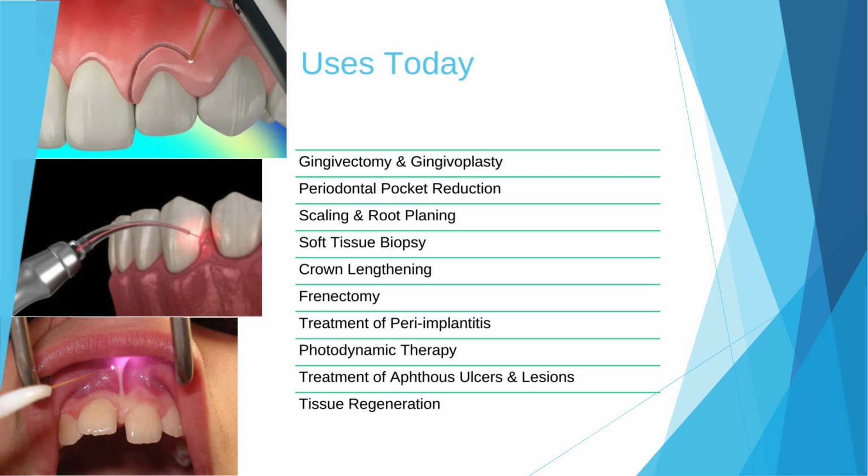Scaling and root planing. To remove bacterial deposits, calculus and plaque biofilm, from the surface of the tooth and its root surfaces, lasers can be used. Scaling and root planing with laser assistance can be more successful and cause the patient less discomfort.